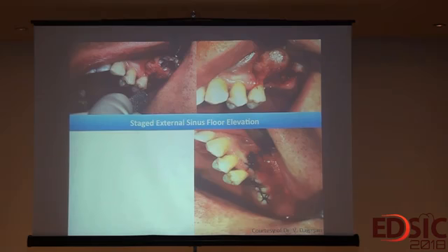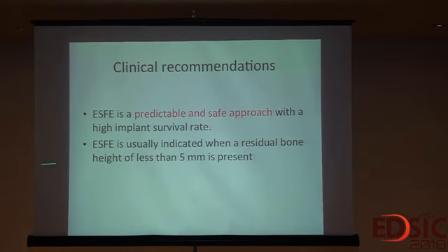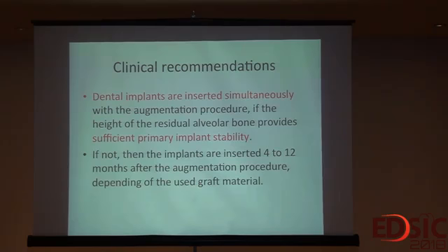And implants are placed 8 to 12 months after the sinus elevation, depending on the grafting material. Sinus floor elevation is a predictable and safe approach with a high implant survival rate when indicated, when a residual bone height of less than 5 mm is present. Implants are inserted simultaneously with the augmentation procedure if the height of the residual bone provides sufficient primary implant stability. If we cannot provide sufficient implant stability, we do not use the implants, we do staged surgery. If not, we place them 4 to 12 months after the augmentation procedure, again depending on the grafting material used.